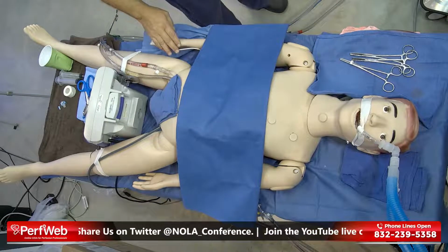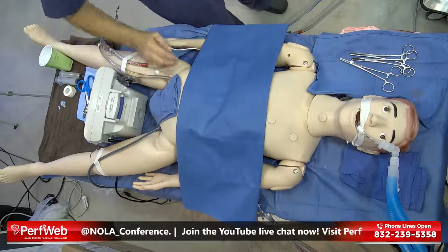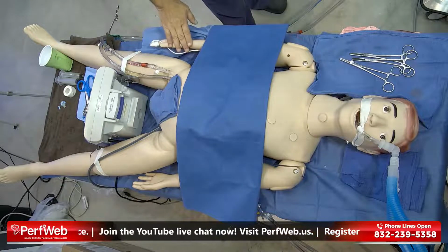We're using a FloTrac on his radial arterial line, which is started off on the left side, which eventually will come to the right side, and we'll show you that during the simulation.